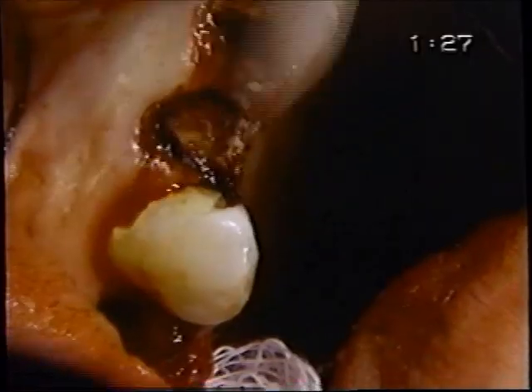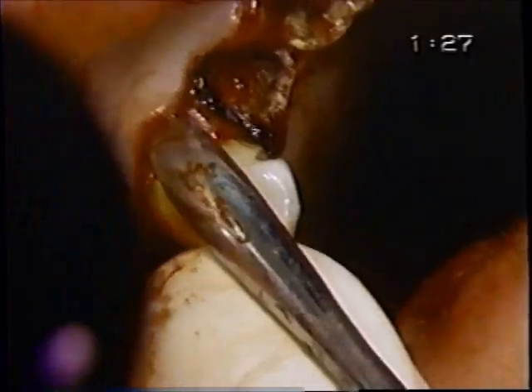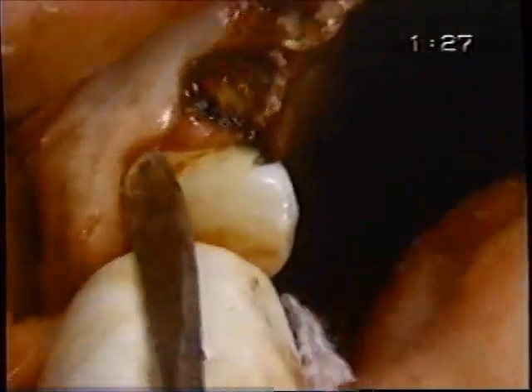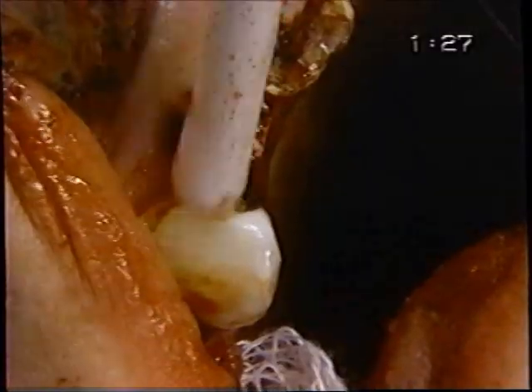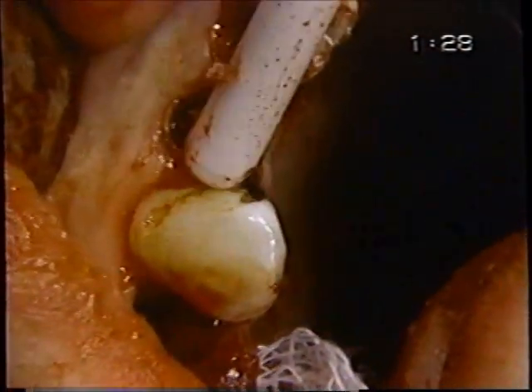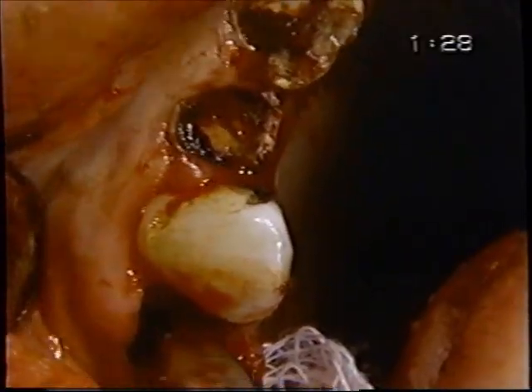Okay, periosteal elevator. There's different schools of thought with regard to the canine, whether to leave it to last. Some people say that it's easier to get out if you do that, but I think it's also easier to inadvertently lose a lot of labial plate when you do that as well. The other school of thought is to take it out first. We'll split the difference here. We've got one out, we've got one still there. We'll go ahead and take out the canine next.